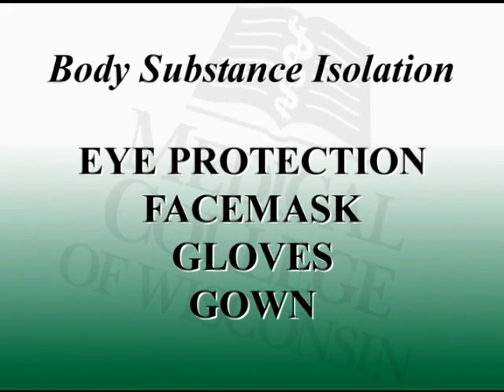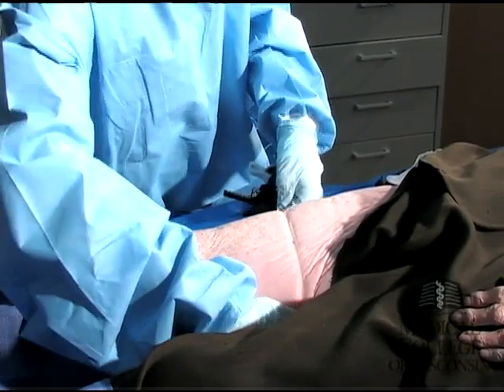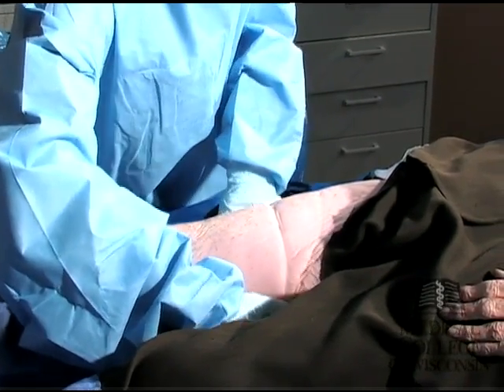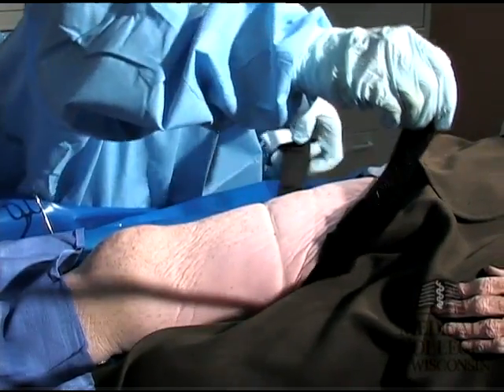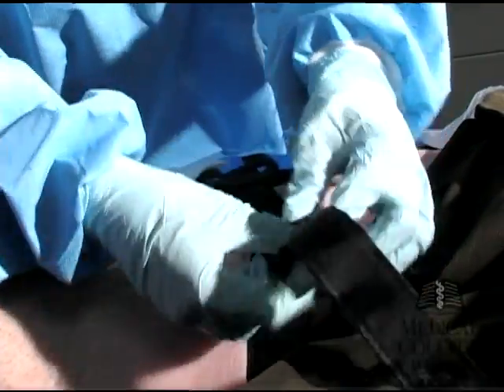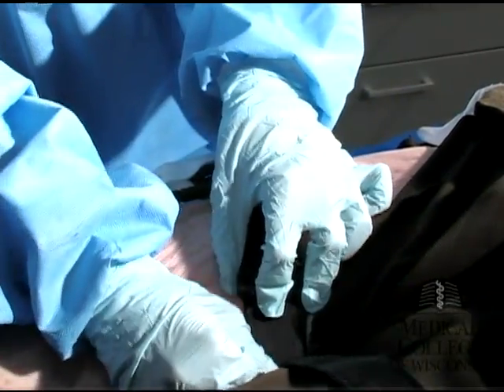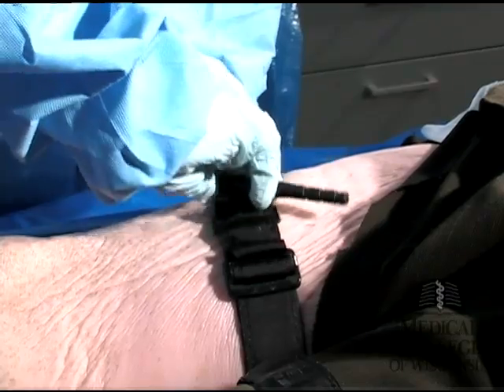The first step in a field amputation is to assure you have adequate body substance isolation. At a minimum, this includes eye protection, face mask, gloves, and some type of fluid impervious gown or suit. Next, remove any clothing and apply the tourniquet proximally to the site of the planned amputation, but not over a joint.